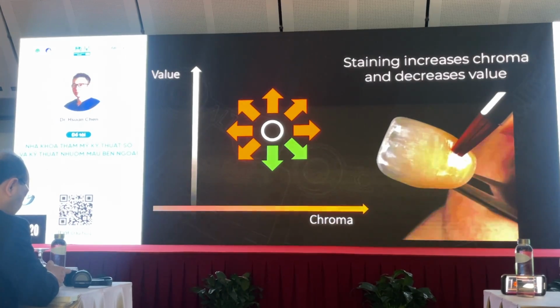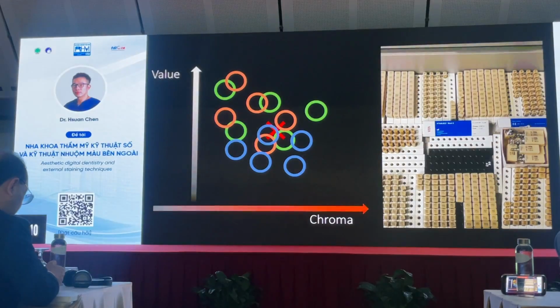This means that this ceramic choice here, there's only two positions it can go into. It can become darker or darker and more orange. So this limits the number of ceramics that we can choose, right? That means if X is the position that we want to be at, and if we draw a line like this, which quarter do you think is the ceramics that we can choose?